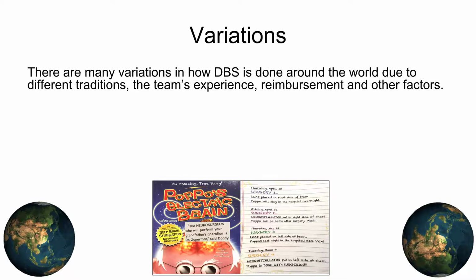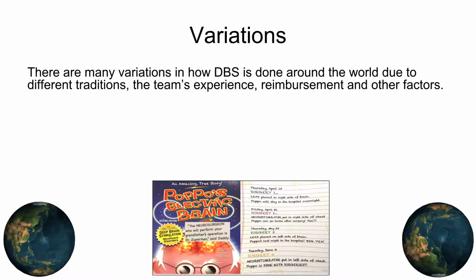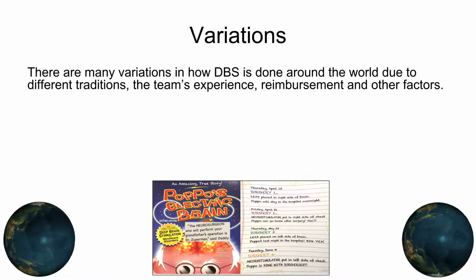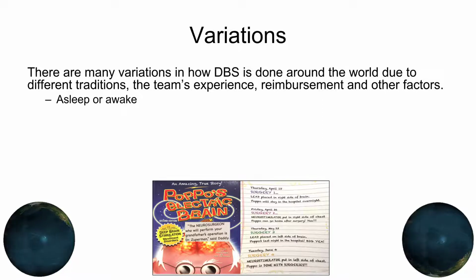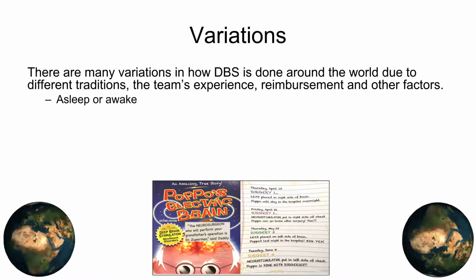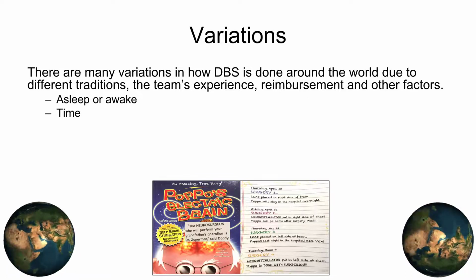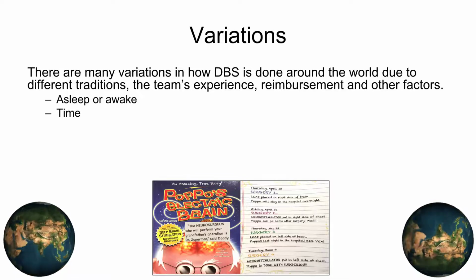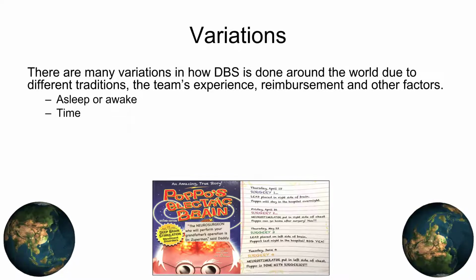There are many variations in how DBS is done around the world due to different traditions, the team's experience, reimbursement and other factors. Some of the most important being asleep or awake, as we have already discussed. The length of the procedure varies considerably, and in some places the tradition is to use extensive intraoperative testing, which might result in a very long procedure, which can be tiresome for the patient.